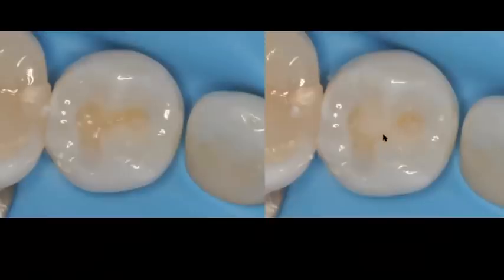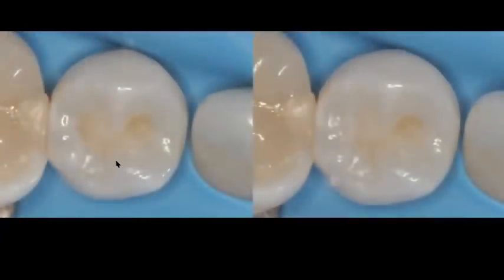So I'm doing my fissure system, everything from the get-go. I'm not leaving anything for burs to be done. I'm going to do this with my explorer and a very small cord packing instrument. I have two increments here. Now I'm going to add my third increment. And you can see with this third increment, I'm trying to rebuild this cusp. And here you can see the groove that I'm leaving. You can see now I'm trying to achieve that Y shape that I initially had planned.